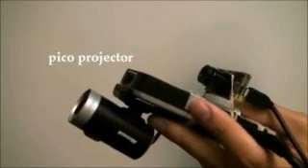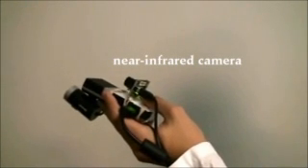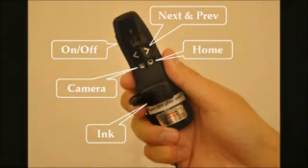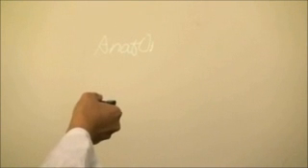The handheld is equipped with a picoprojector for displaying medical content, a webcam for capturing pictures or videos, and a near-infrared camera used to track an IR laser pointer for input. The pointer is a commodity radio-based slide presenter. The red laser diode has been replaced with an IR laser diode whose light is tracked by the IR camera, allowing pointing, menu selection, and image annotation.